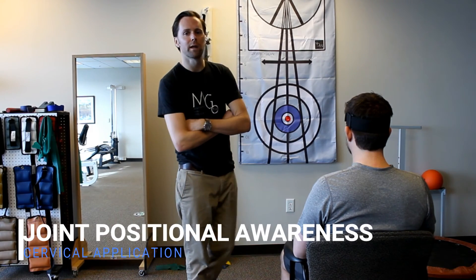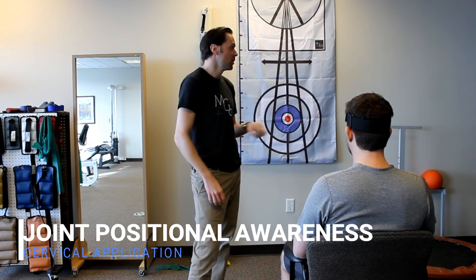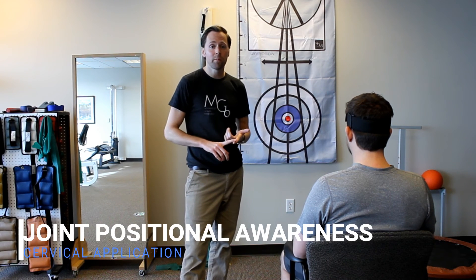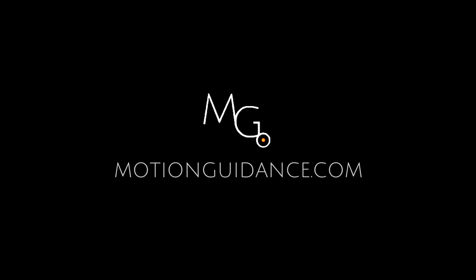That's an example of the visual feedback relocating exercise — a joint positional awareness exercise with rotation to the right. You can certainly do that for looking up, looking to the left, looking down, or wherever you see fit with your rotation direction.